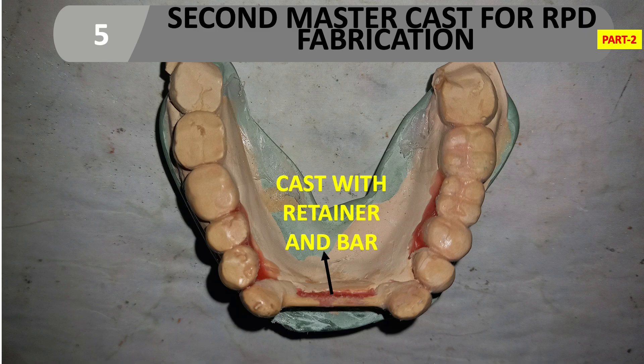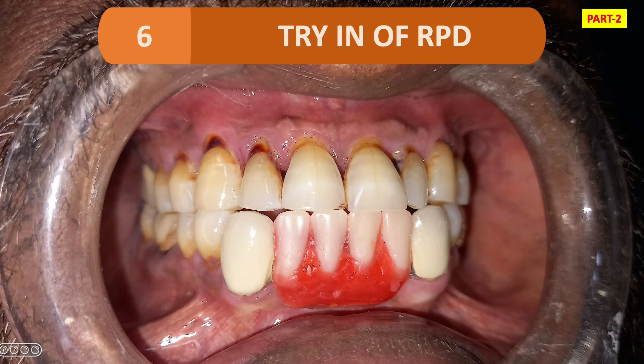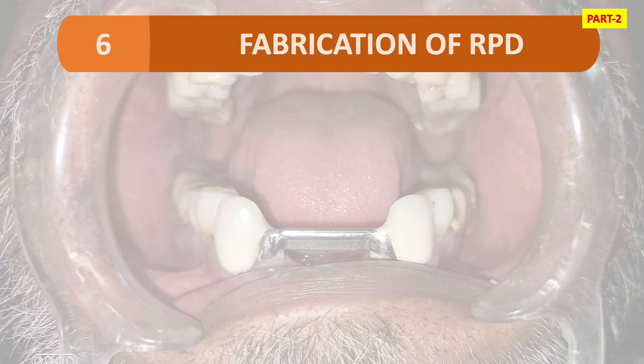As you can see in the second master cast, we have the cast with retainer and bar. Now, for the try-in of the RPD, we make an occlusal rim and do teeth arrangement as in conventional RPD, then try the RPD. All steps in RPD fabrication are the same as conventional RPD up to de-waxing; after de-waxing the steps are different.